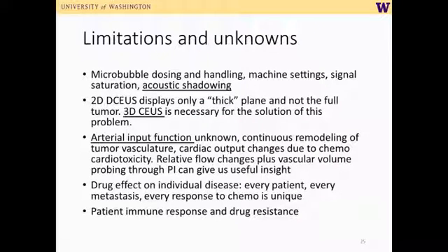Now, in closing, I'd like to say there are some limitations and unknowns. Microbubble dosing and handling is very important. Machine settings, there are differences from machine to machine. Signal saturation and acoustic shadowing, which I already touched on. 2D contrast-enhanced ultrasound displays only a thick plane and not the full tumor. So eventually we want to do this in 3D contrast-enhanced ultrasound. And this is already happening in various sites in the world. The arterial input function is unknown, and continuous remodeling of the tumor vasculature, including cardiac output changes due to chemocardiotoxicity, are making our life difficult.